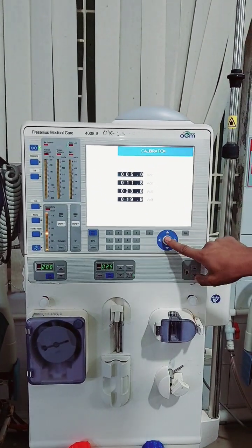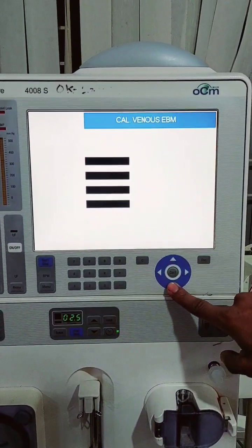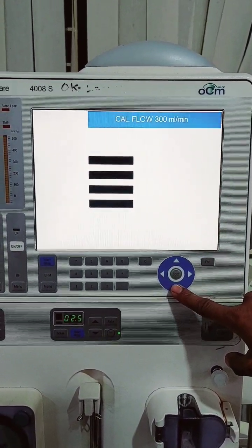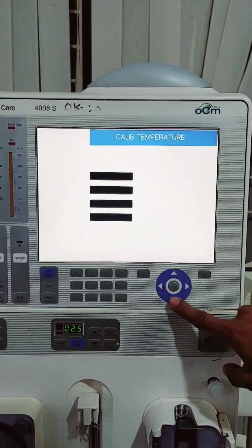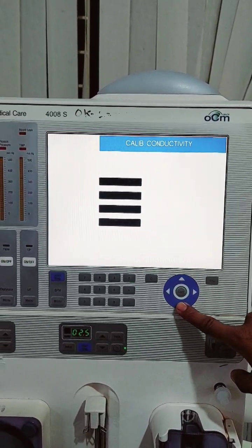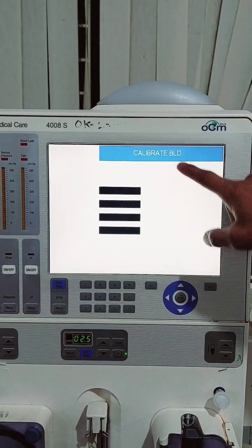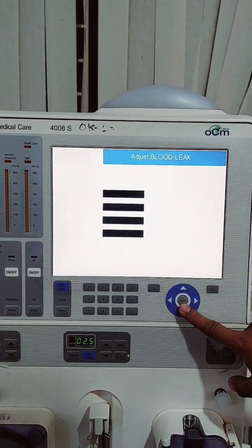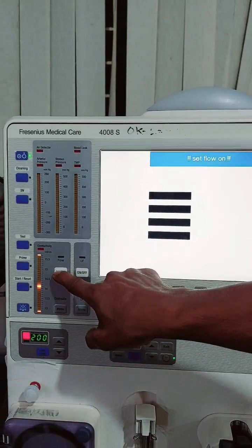Calibration. Press the confirm key. Calibrate blood. Confirm key. Okay, follow on.